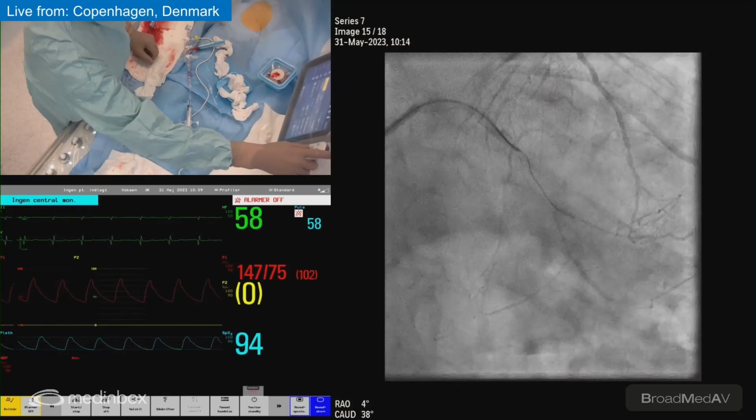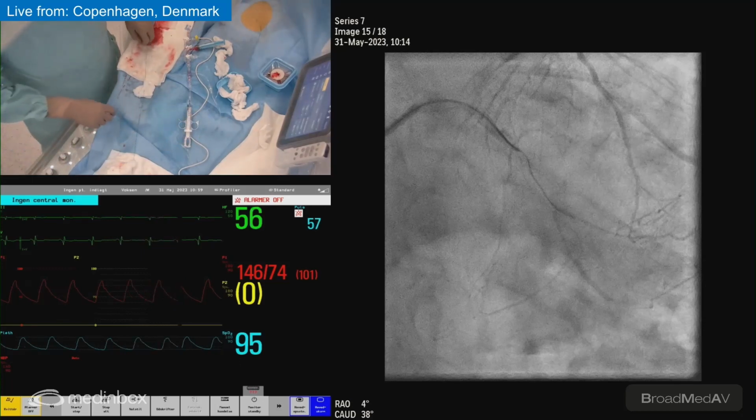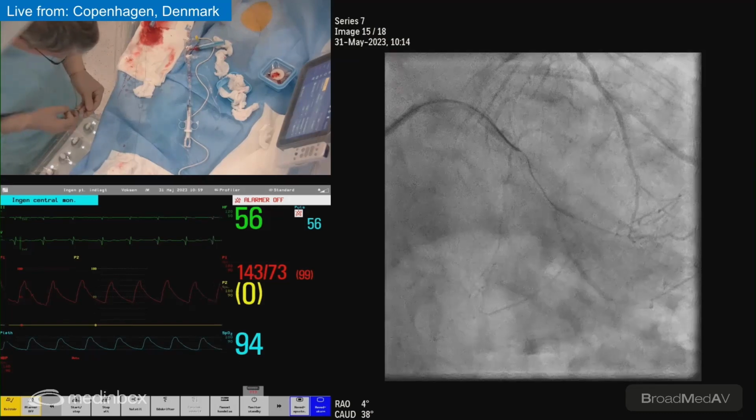At least this one we can see, and we are in the same angle. So we're going to just stand distal to the branch taking off to the left in the screen with the 38 millimeter stent here.